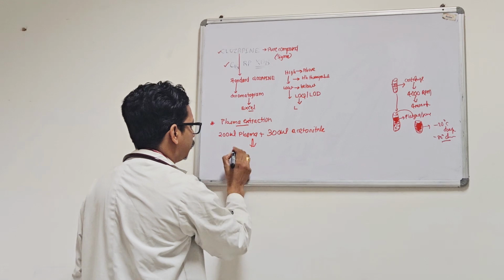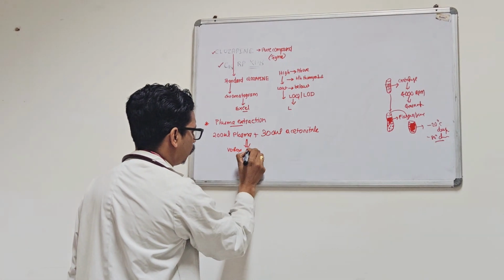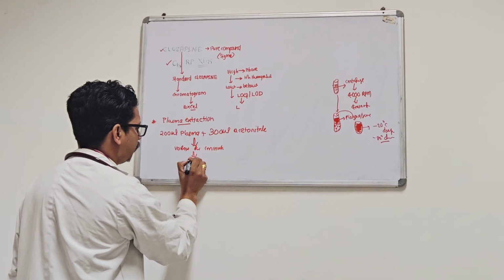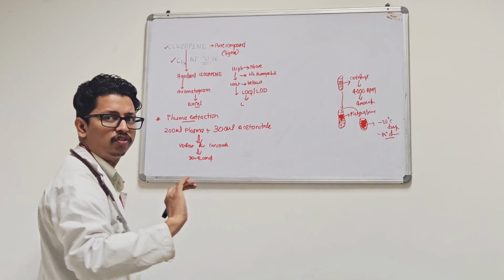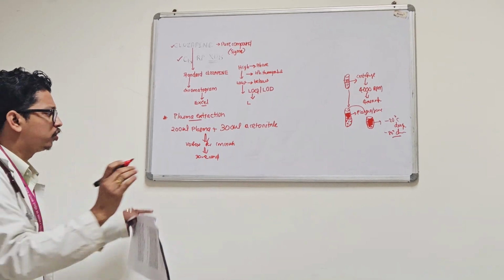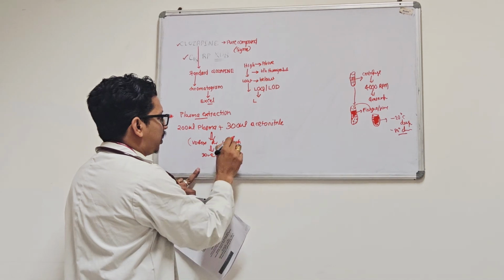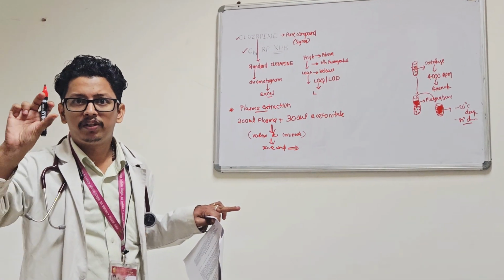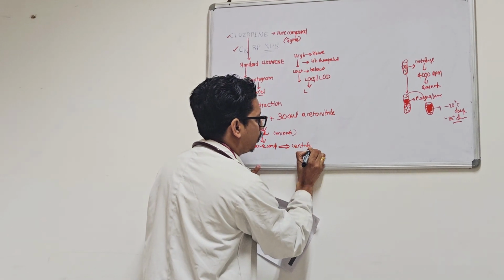Immediately after adding, we will keep it for vortex for 1 minute, and after that we will keep it for 30 seconds. 30 seconds उसमें ऐसा ही रखेंगे. उसके बाद we will vortex करने के बाद some of the compound will sediment out and some clear fluid will be there. But after that we will centrifuge the same Eppendorf tube.